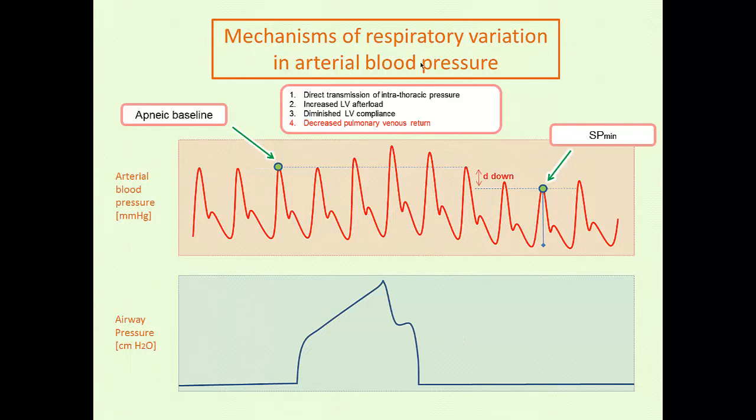What is the determination of this delta down phenomenon? Certainly, there are multiple causes of the delta up, but the more important aspect is this delta down, and why it's more important I talk much more about in Chapter 8. But essentially, the delta down reflects a delayed response of right ventricular output. So this response, although it's being measured during expiration, is actually an inspiratory event.